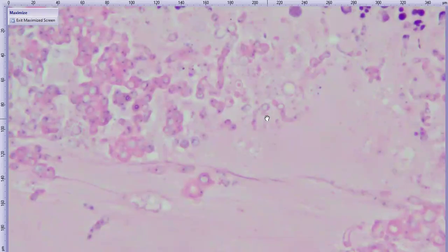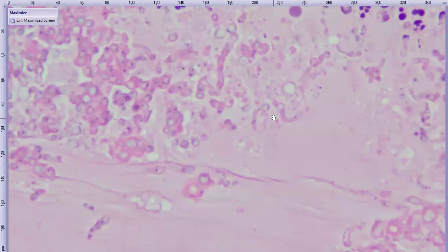Yeah, some of them have what look like nuclei, but it's interesting that a lot of them seem sort of empty. But these guys seem to have viable stuff inside them, the sort of basophilic nuclear material, maybe. These guys have sort of shrunken eosinophilic stuff, which does kind of look dead. So yeah, some of them are probably viable. Maybe some of them are non-viable, which is interesting given that, as far as I know, the patient wasn't being treated with antifungals by the time of enucleation.